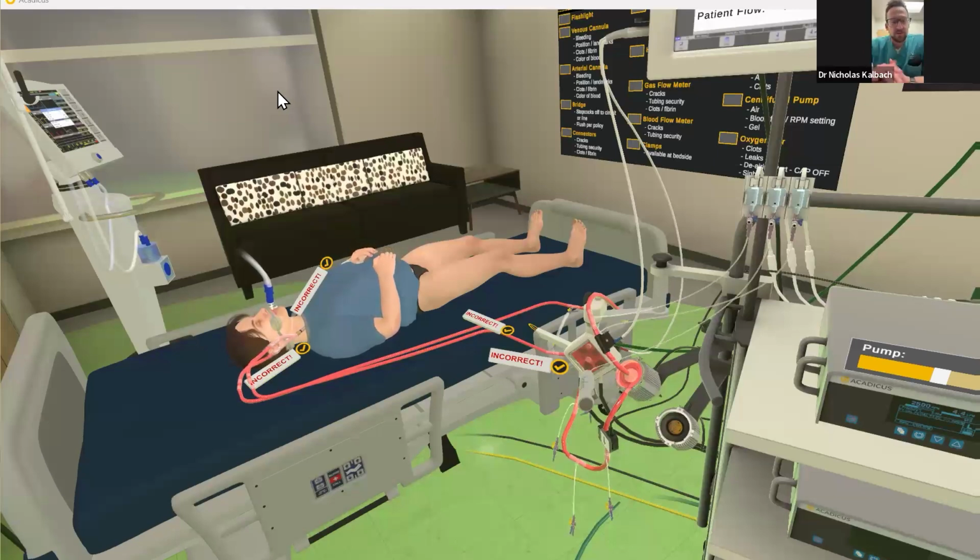So, if you were to take it from the venous port, you would essentially go from the neck up into what you can see as the simulated circuit. This will flow through towards this cylindrical type of apparatus, which is actually our driver. That is the part that has the magnetic propeller that is going to actually move the blood. That is coming around and into the diamond shape portion or apparatus that is here, that is the oxygenator. That is what's performing both the oxygenation and the ventilation of the blood that is drained from the body.